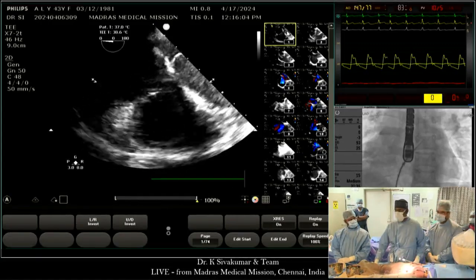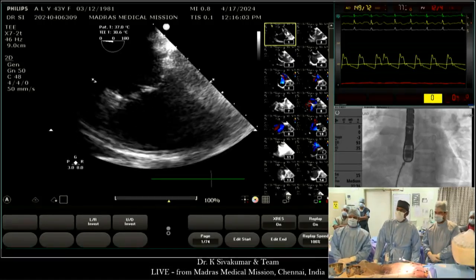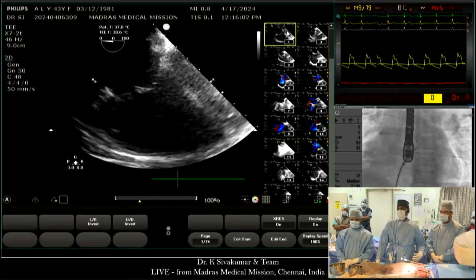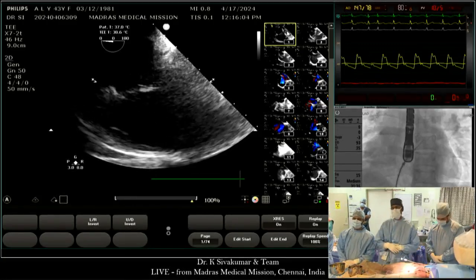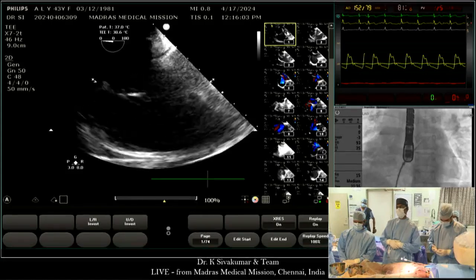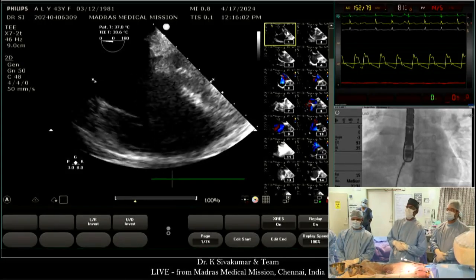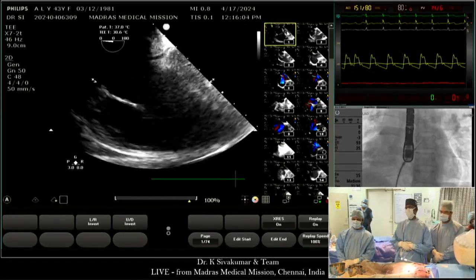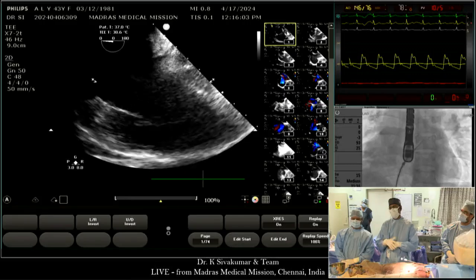Okay, thank you. Sivakumar, back to you. I heard all the opinions. Of course, we respect a lot the opinion of senior surgeons like Dr. Zuhair, and I would thank the senior surgeons for coming to these meetings. It's extremely good to have surgical participation. We had a surgical discussion. This right upper pulmonary vein is 3.5 centimeters superior to the cavo-atrial junction, and so the surgeon felt that in a 43-year-old lady, he would prefer to leave it to drain into the right superior vena cava. The vein was measuring about 9 millimeters in diameter.